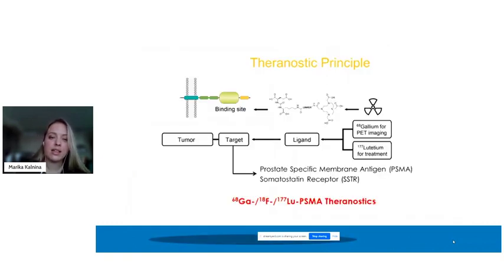And next, we actually started this with some of the patients, but we still need to go further, to the theranostic principle for metastatic castration-resistant prostate cancer patients. The principle is that we first target the ligand for imaging with PSMA, and later, when it's positive and metastatic, we can use lutetium PSMA to treat those patients.